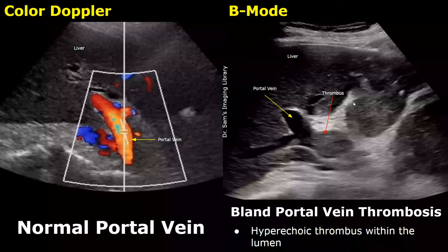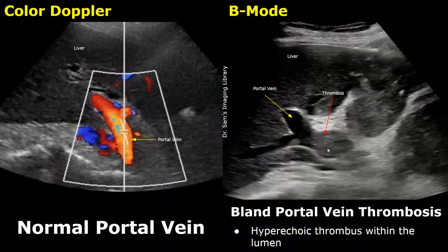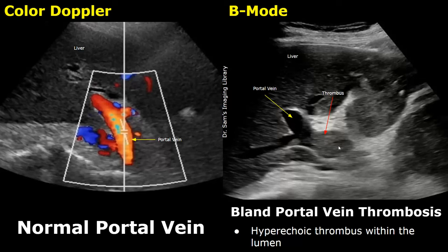In portal vein thrombosis, a clot forms within the lumen of the portal vein. There are two types: the first is bland portal vein thrombosis. A bland thrombus does not form due to liver cancers or other cancers — it can form due to liver cirrhosis, pancreatitis, or other abdominal infections.